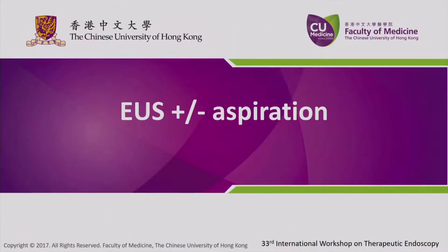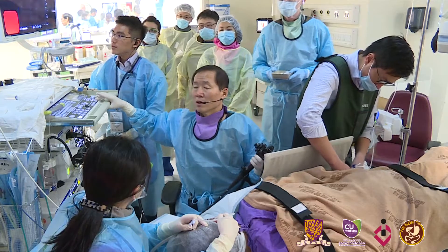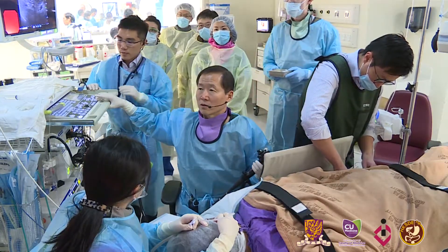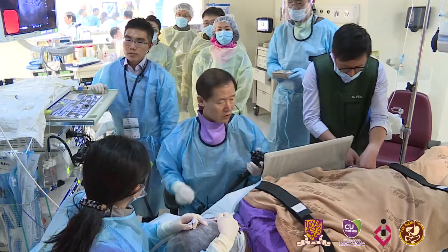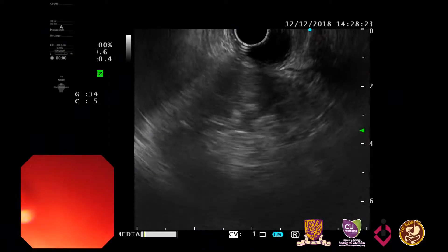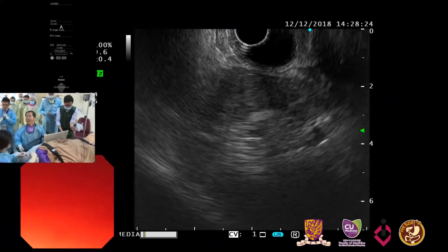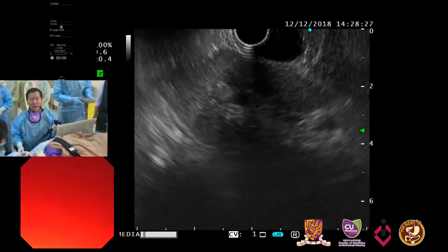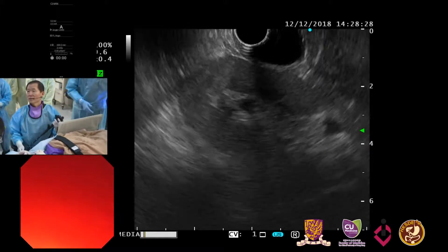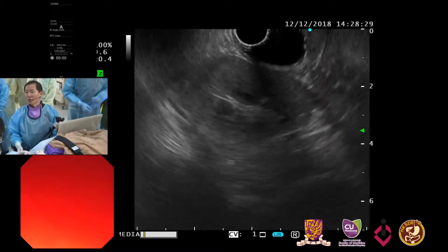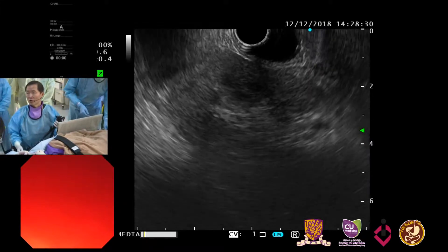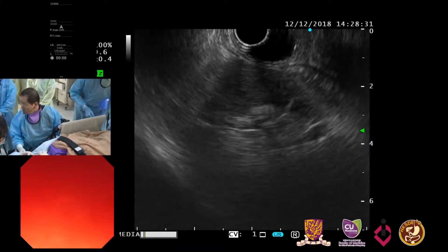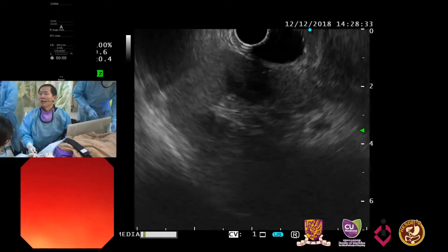Today we are going to have EUS plus or minus aspiration. I inserted my scope into the duodenum, and now we are looking at the right kidney here. Do you have an EUS view? Yes, we have an EUS view.